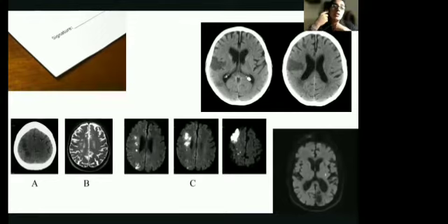So our job then is to not only do a carotid Doppler, but also a CT angio of the head and the neck. Now, we have had patients who also had aortic thrombi. We have had patients who had thrombosis sitting right at the origin of the carotid arteries, and that also can help us determine the robustness of the thrombolysis or the potential for further thromboembolism, etc., in people with strokes.